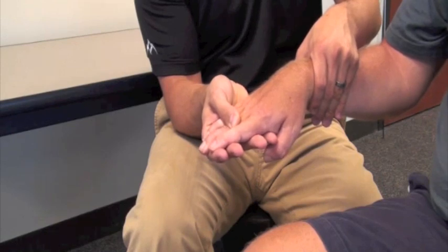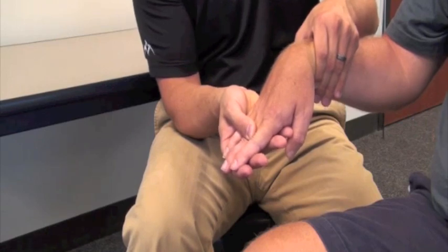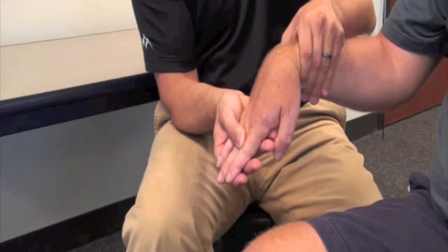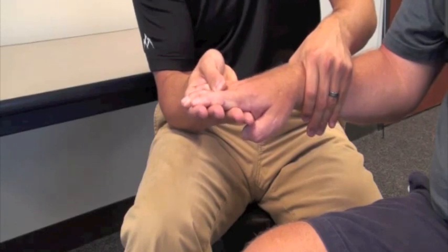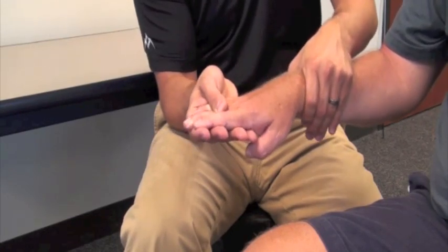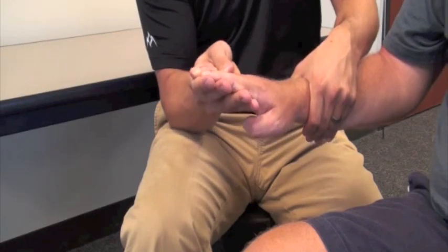You don't want to set the wrist angle lower than 35 degrees of flexion due to increased pressure in the carpal tunnel and carpal instability concerns — you really want to avoid too much flexion. It may be common for some chronic patients to be a little below neutral, but you really want to try to keep that wrist angle as close to neutral as possible to start. With Tony, we'll start him off at plus five degrees.